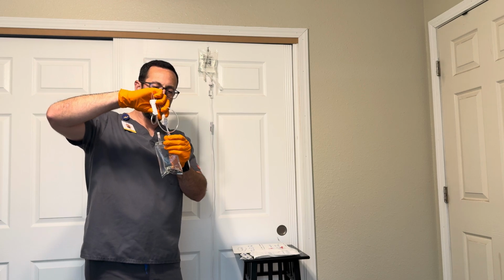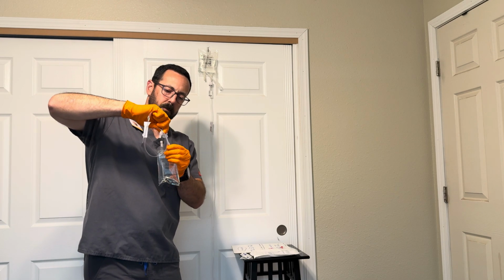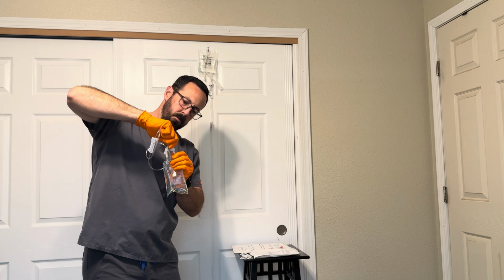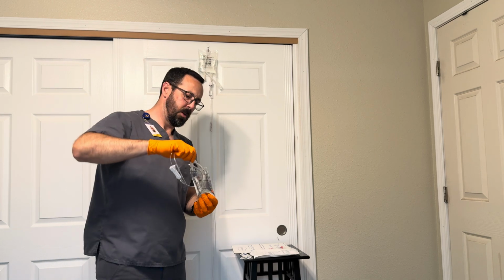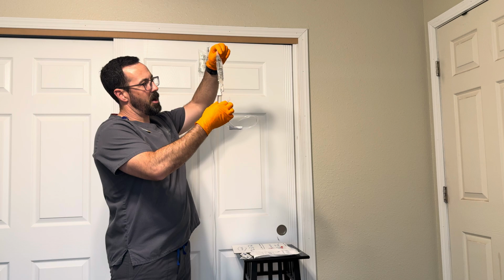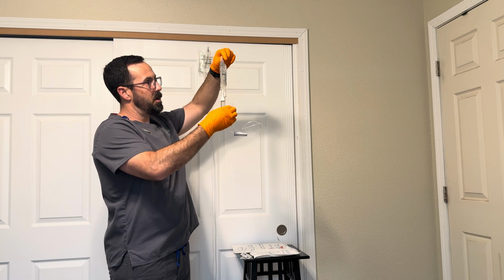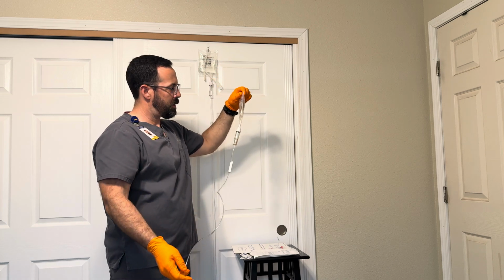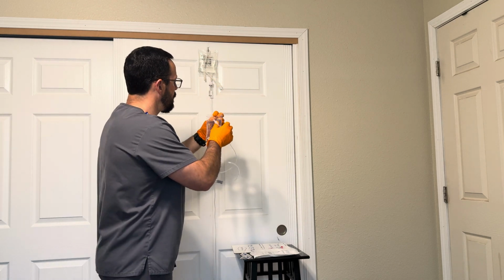So straight into the spike port. I'm going to fill my chamber halfway. And then we need to prime our line.